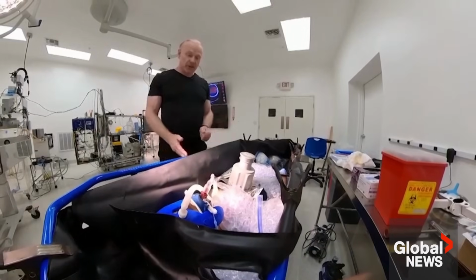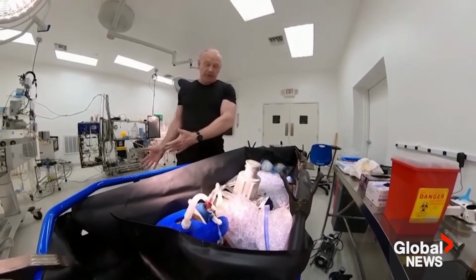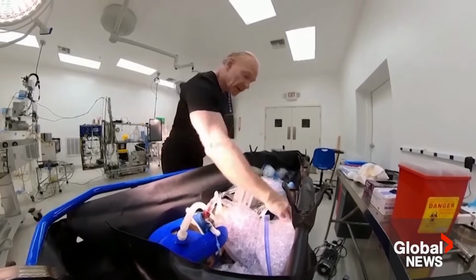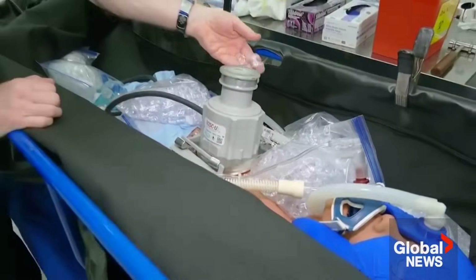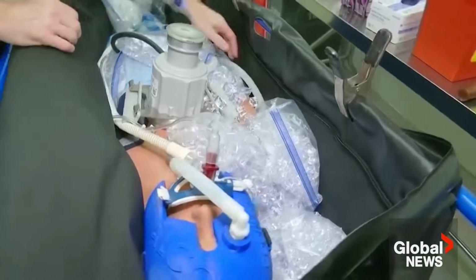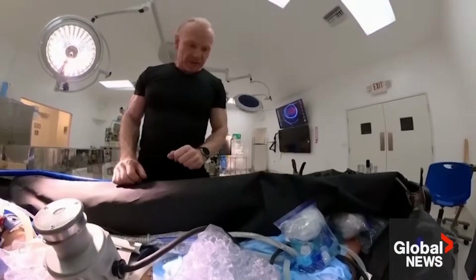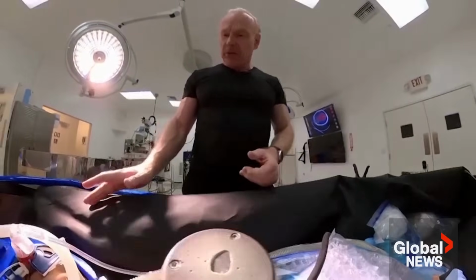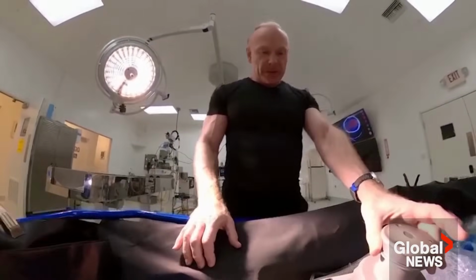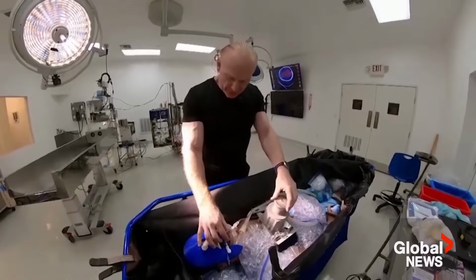The first stage of the procedure, we have to wait until the patient's been declared legally dead. We then move the patient from the bed into this ice bath, and we're going to cover them in ice and add some water. Obviously we don't have that here, but we're going to use this device called the squid to circulate icy water around the patient. That accelerates the cooling, external cooling. At the same time, we're going to apply a mechanical CPR device. It's much more efficient and less tiring than manual CPR, and a respirator.